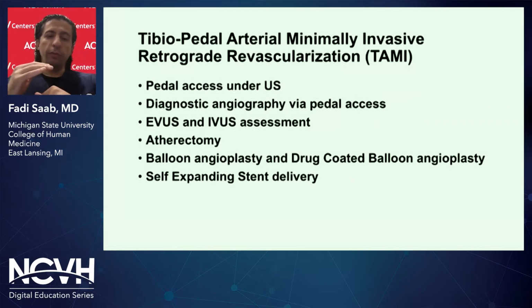And you perform pedal access using ultrasound guidance. You perform diagnostic angiography via pedal access. You utilize extravascular ultrasound. You can also utilize intravascular ultrasound. You can perform atherectomy, balloon angioplasty, drug-coated balloon angioplasty, and even deploy self-expanding stents if necessary or if needed for those cases.